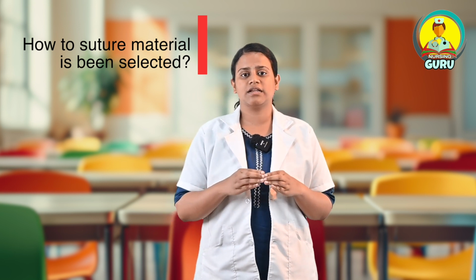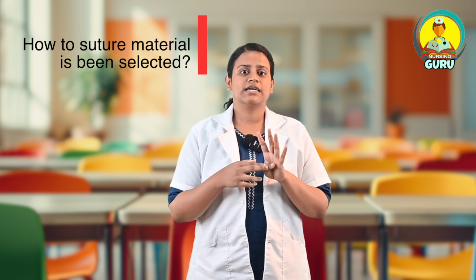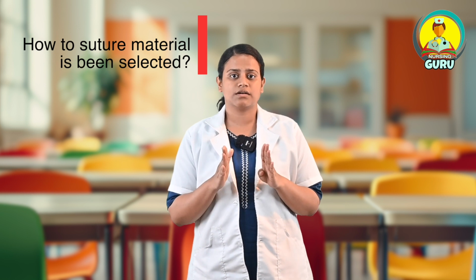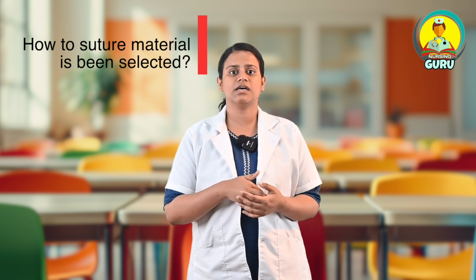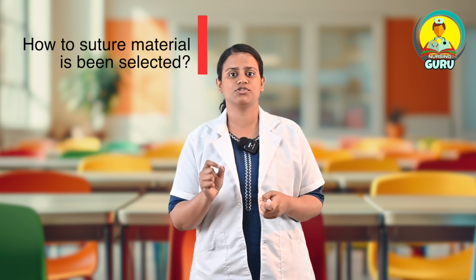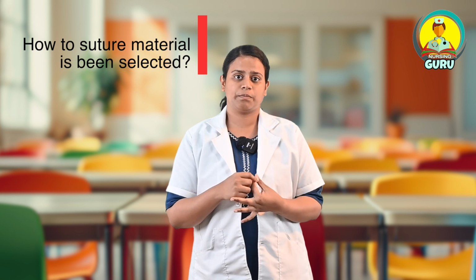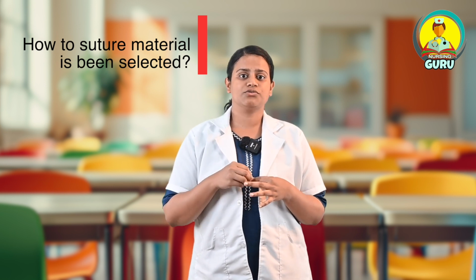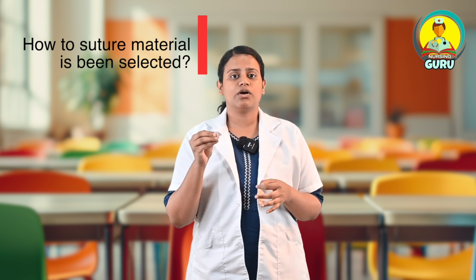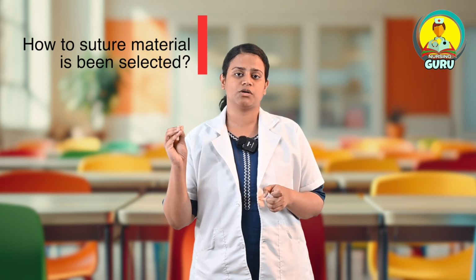Selection of suture material is always done by these 5 major points. First one is the condition of the tissue or condition of the wound. Seeing the condition of the wound, how deep it is, how mild it is, how moderate it is, we select the suture material. Second one, the tissue that should be repaired, whether it is internal tissue or superficial or external tissue. According to the tissue, we have to repair using some suture material.